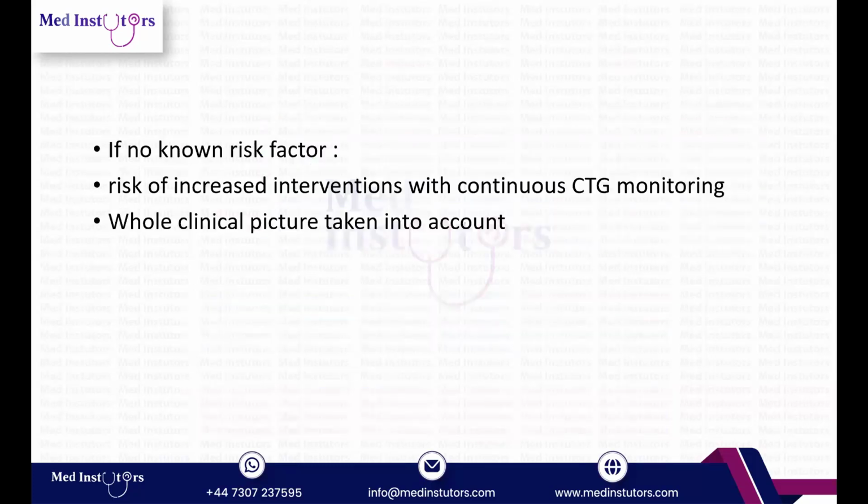After this, if there are no known risk factors, correct, if she's a completely low risk patient with a healthy baby, healthy mother, you can tell her one more thing, that additional CTGs, if done unnecessarily, could also increase the risk of unwanted interventions. And thus, it is very crucial that we take the whole clinical picture into account whenever making these decisions.